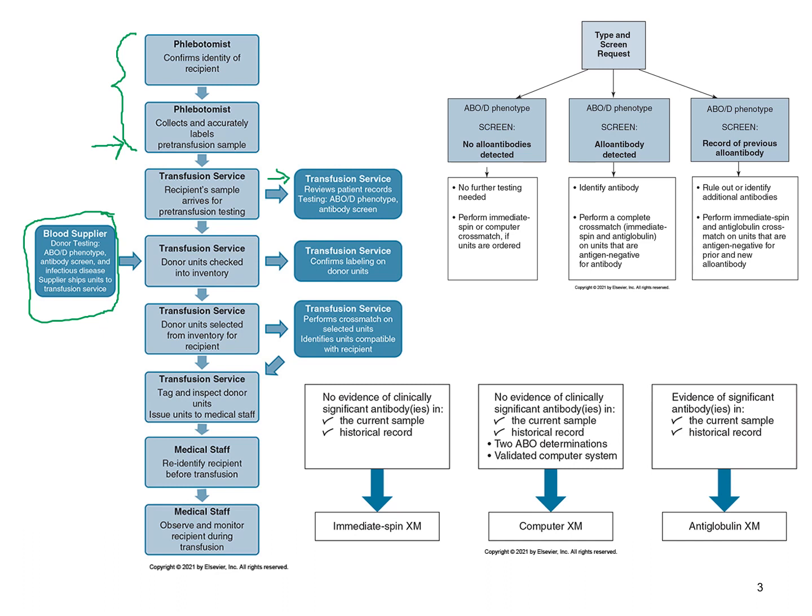But one of the additional steps that has to be done anytime blood products are received into a facility, whether you do the collection at your site or whether it comes from somewhere like the Red Cross or another blood center, is that once it gets in your hands in the transfusion service, you are responsible for doing what they call a recheck, a donor recheck. So you have to recheck that blood type before you put it into your inventory, just as a safe protocol to make sure that there weren't errors that happened before it ever got to you.